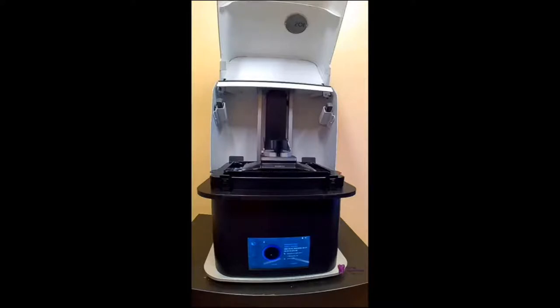So here you can see the printer's finished printing. Again, it wouldn't be printing this fast. This is, again, a time-lapse video. But once this is done, we can remove it from the build platform, do the post-processing, and deliver this hybrid to the patient. This can be done also for temporary crown and bridges, etc. So that's one of the beautiful things about this printer is the speed.